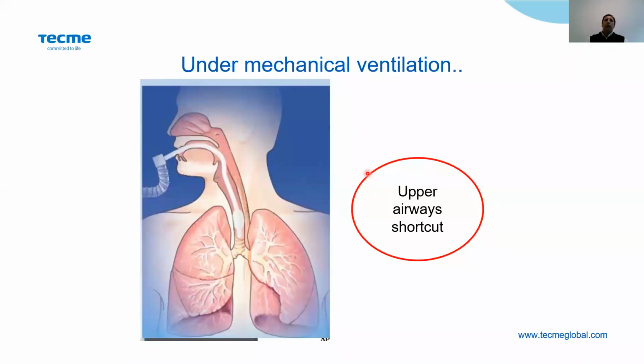The machine obliges you to select one or the other because in normal ventilation we are going to use an endotracheal tube. So we are going to bypass the upper airways, and we lose all the capability of the body to produce humidity and to warm up the gas that is delivered to the patient.